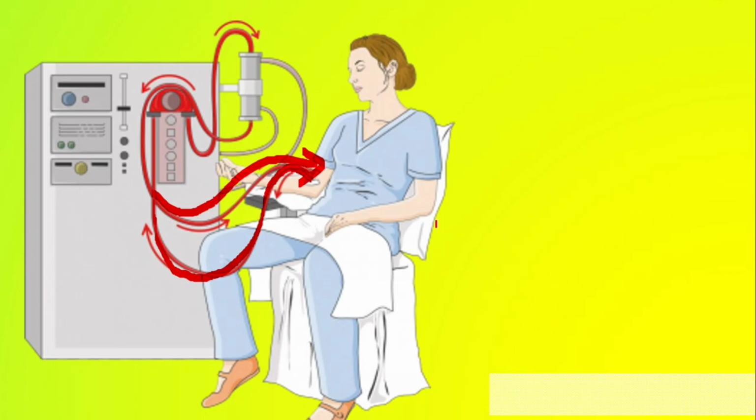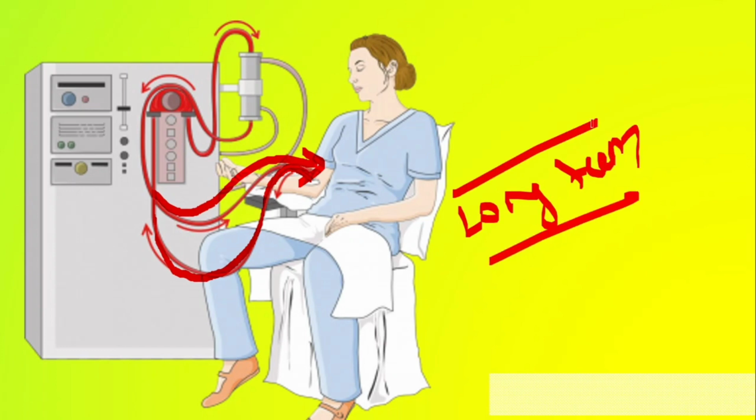The vascular access for long term dialysis, the main important problem is the vascular access. How to take the blood from the patient to the machine and return it. Because after repeated cannulation, the artery will get damaged. Even the vein might get thrombosed.